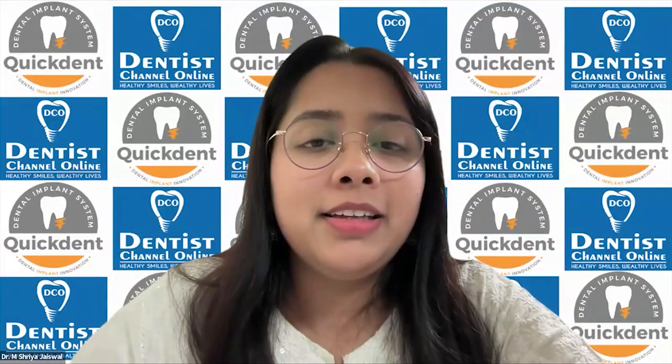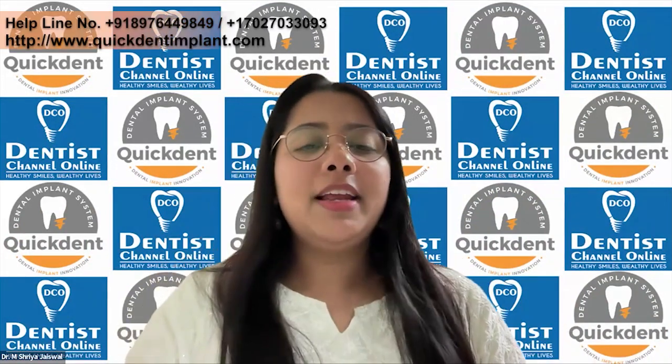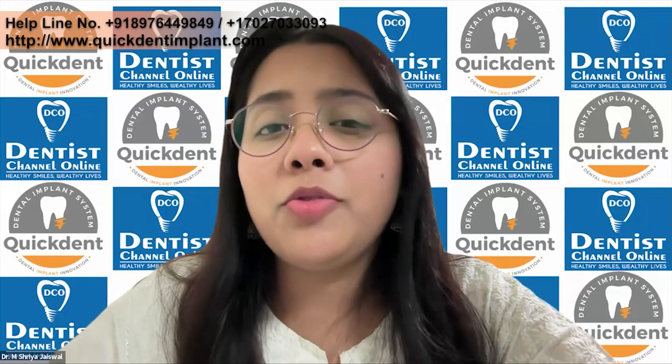Next is Dr. Kostavkar. Drilling angulation should be 30 to 45 degrees.